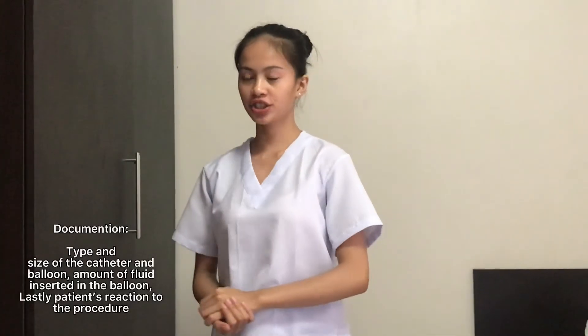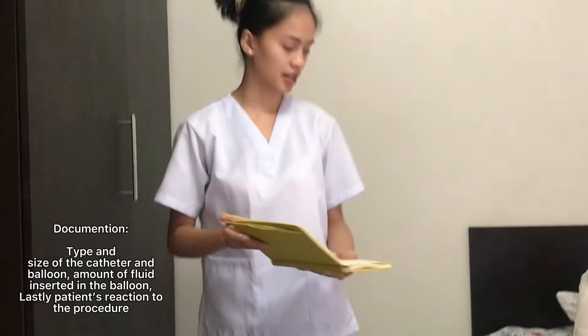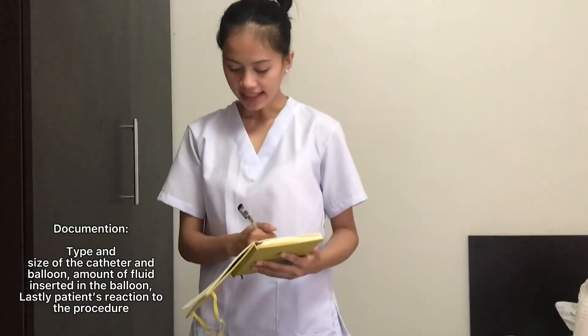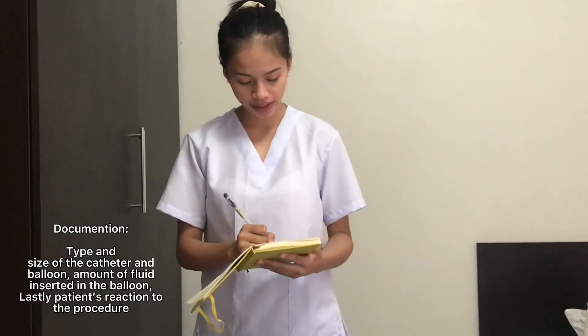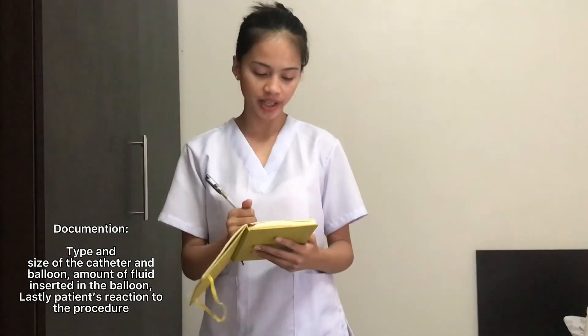For documentation, document the type and size of the catheter, the balloon, the amount of fluid inserted, and the patient's reaction during the procedure.